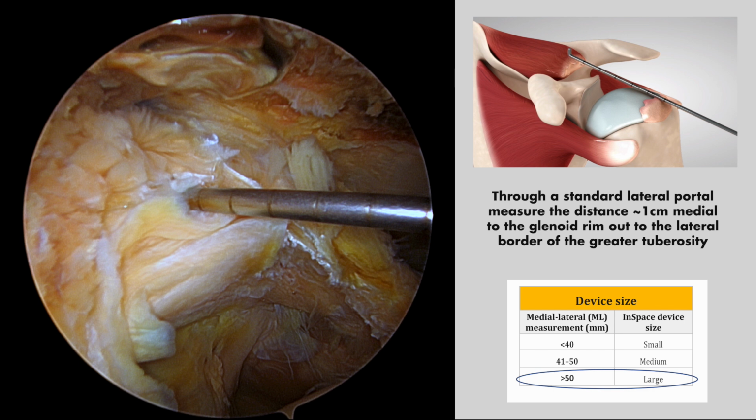Now, the device is sized based on your measurement, and in this situation, once we have a measurement greater than 50 millimeters, we would select a large size implant.